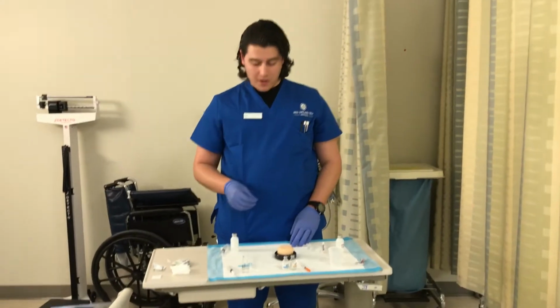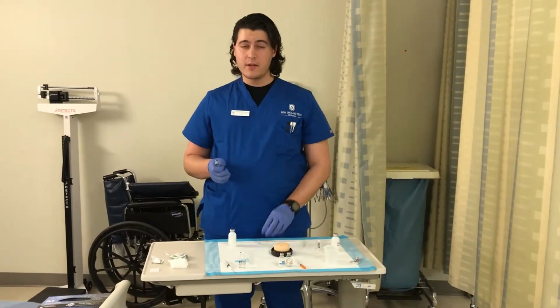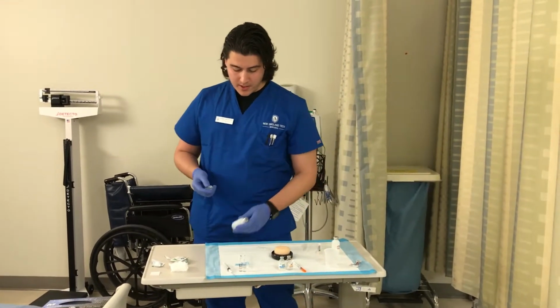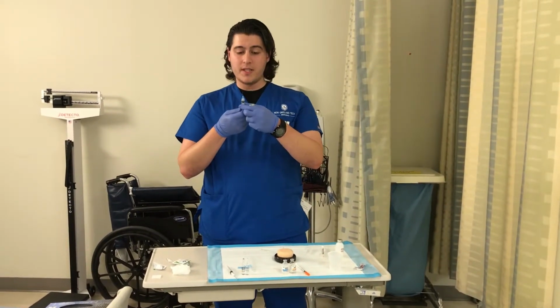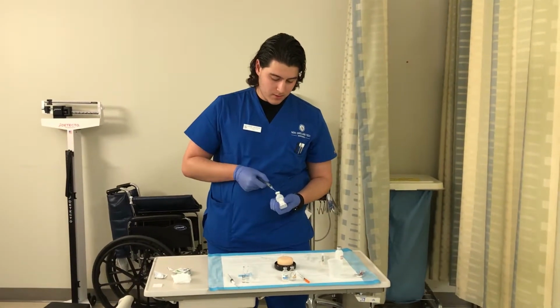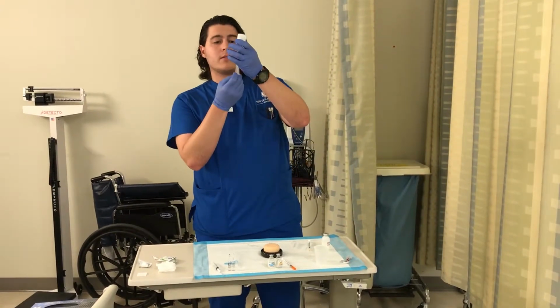The next one I'm going to talk about is your IM injection. These are a little bigger. These go in the deltoid mainly, or ventrogluteal. So we can do the same thing. I'm going to withdraw, say, 2 mLs here. So I have my syringe. I'm going to stick it in, and you always withdraw like this.